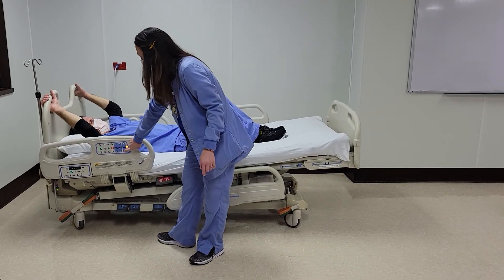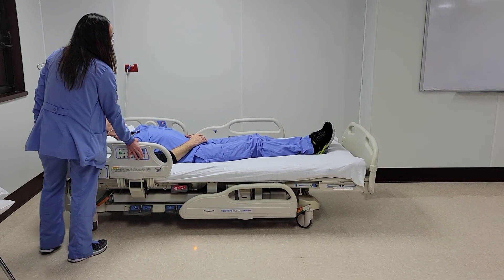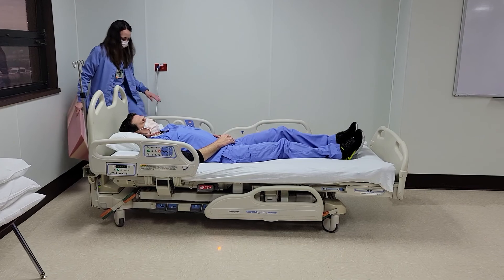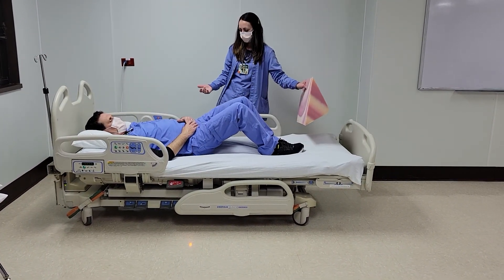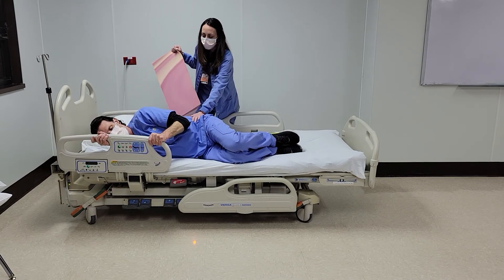We're going to go ahead and flatten the bed. We're going to talk about rolling and positioning next. We're going to get Steve to roll to one side — his right side. We're going to have him bend his knees and scoot his bottom towards me, then roll to the right. Reach across with the hands gives him a little momentum — knees bent and he's on his side.